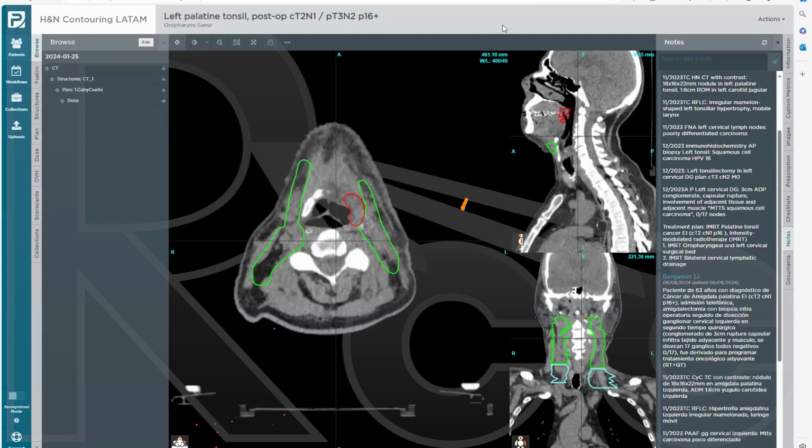Yes, excellent question. Yes, we use daily IGRT, so using cone beam CT daily to assess the patient. If the patient is losing weight or I have some concerns on cone beam CT, then I will resimulate the patient and make a new mask. For definitive radiation therapy, I think around week 4 sometimes is a good time. If I'm seeing a good tumor response on the cone beam CT or on clinical examination, I may resimulate the patient to readapt the tumor volumes.